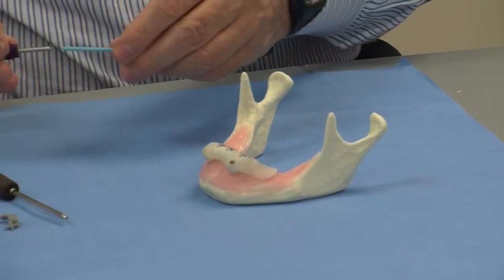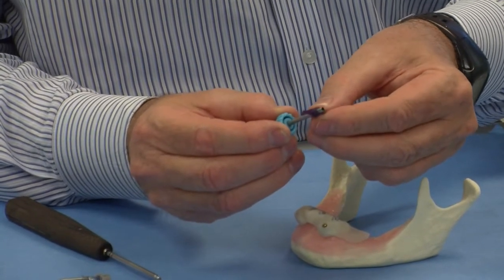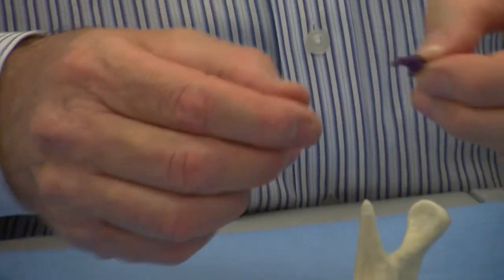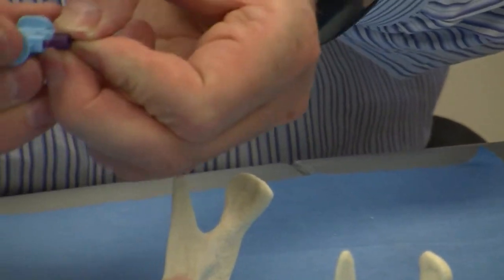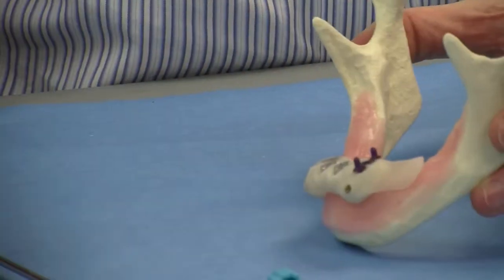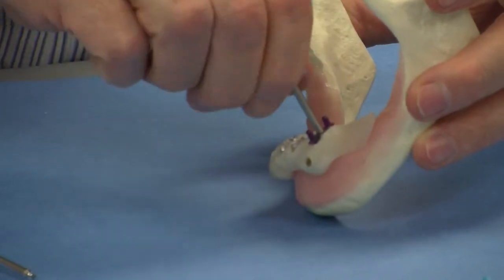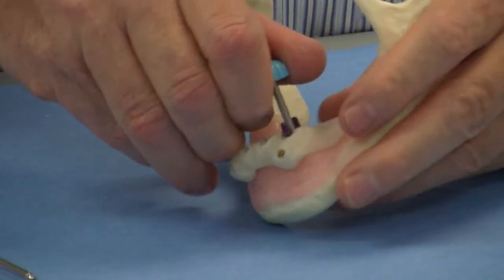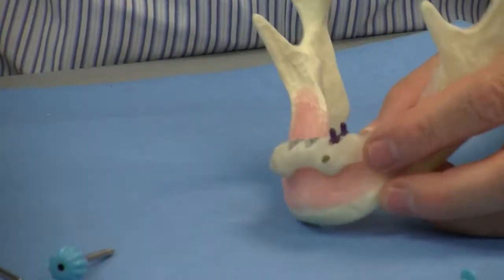In order to do that, we are going to use a specific narrow diameter punch or tissue punch, and this is inserted with the same tool, and by turning we can have a very precise cut.